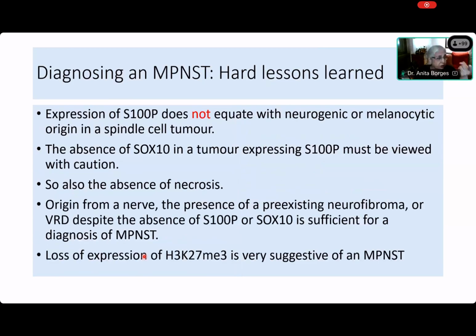Okay, and the lesson about MPNST is expression of S100 protein does not equate with either neurogenic or melanocytic origin in a spindle cell tumor. We saw a case just now which had S100 protein and CD34, and it was not either a neurogenic or a melanocytic tumor. Absence of SOX10 in a tumor expressing S100 protein must be viewed with caution. So also the absence of necrosis.